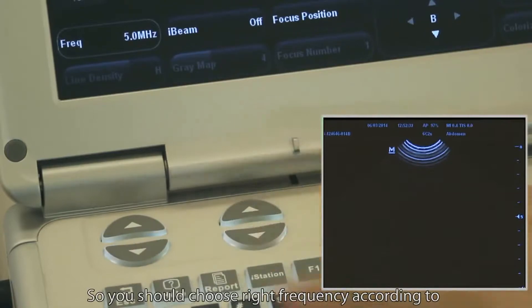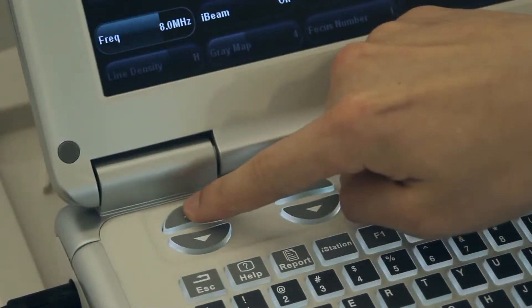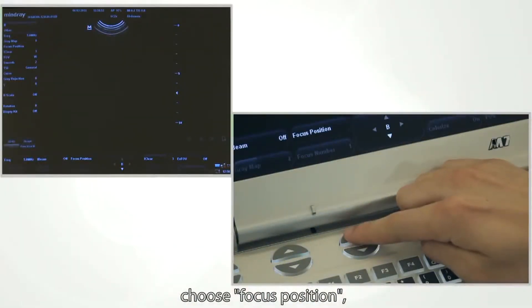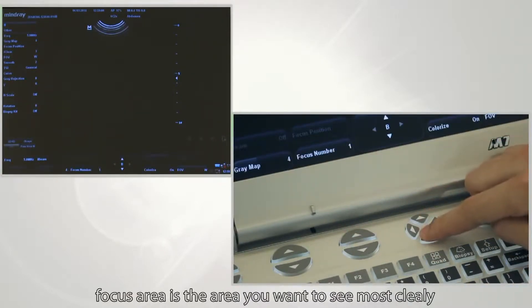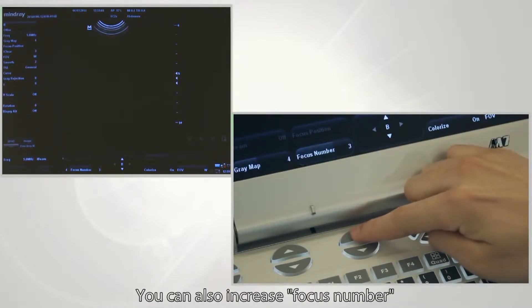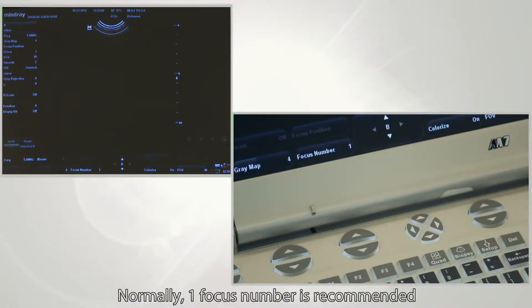Choose the right frequency according to animal size and weight. Next, adjust focus: choose the focus position and move the focus arrow to the desired area of observation. The focus area is the area you want to see most clearly. Select the number of focus areas and their positions. Usually one focus area is recommended.